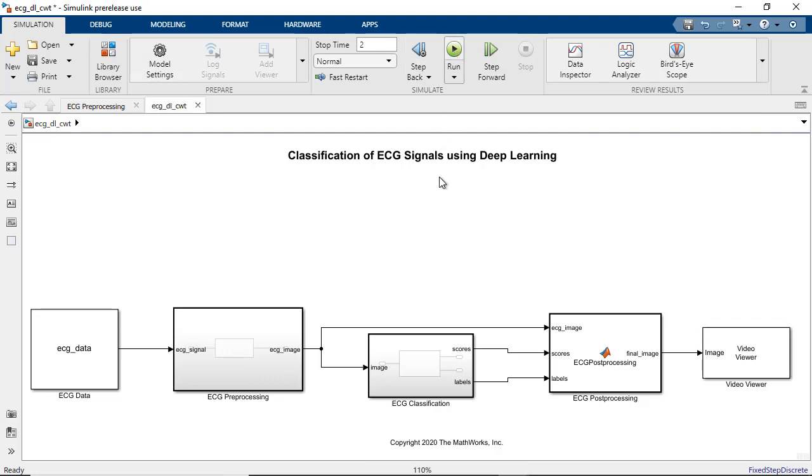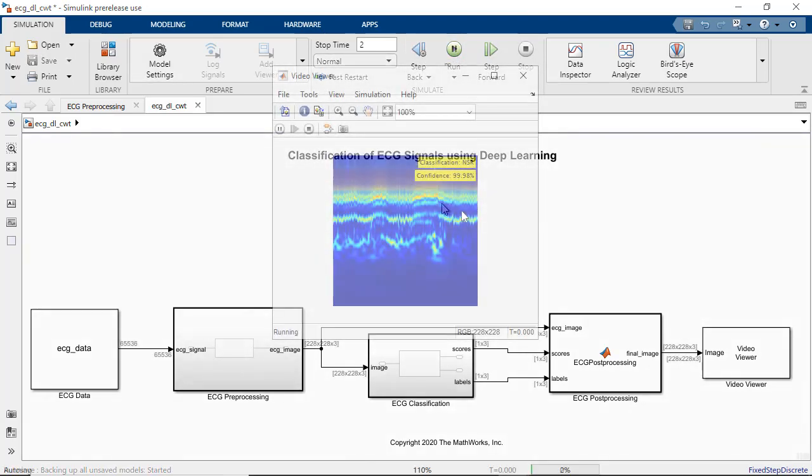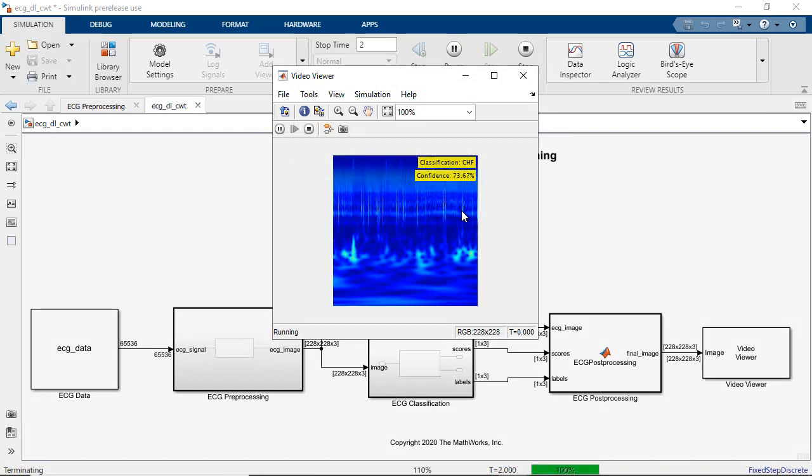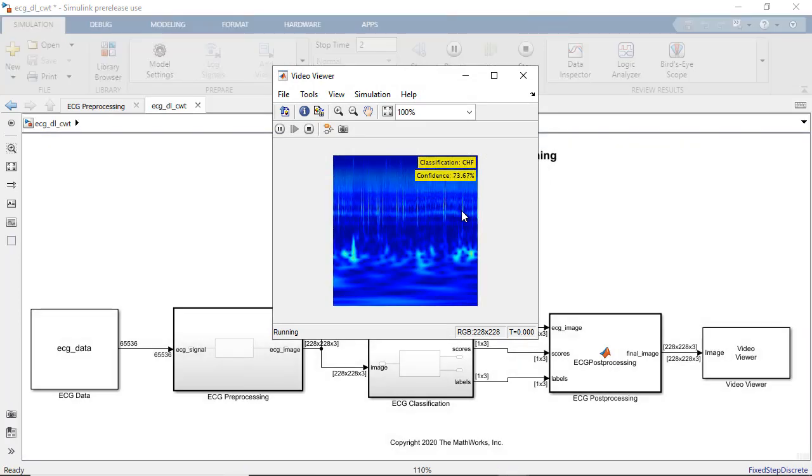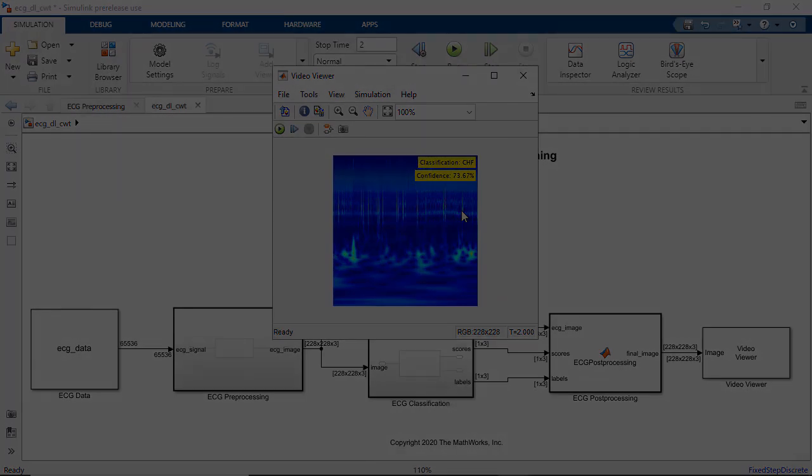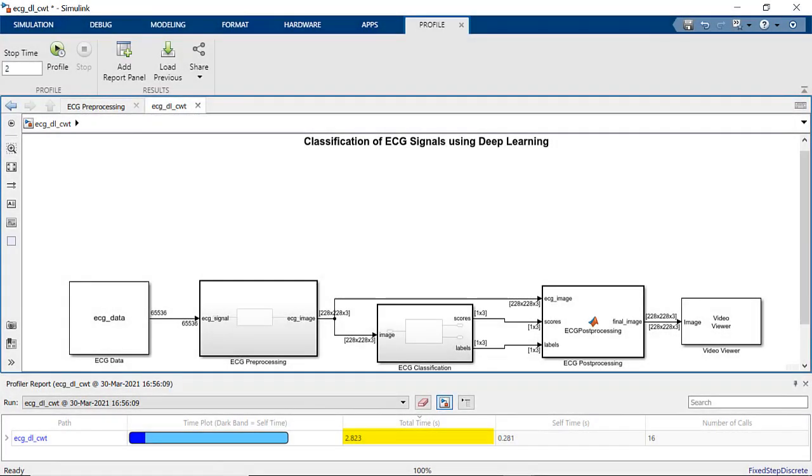Let's go ahead and run the simulation. We see the same results as before but with a nice boost in speed. Execution time using the GPU is about 2.6 seconds which is about 3 times faster than using just the CPU.